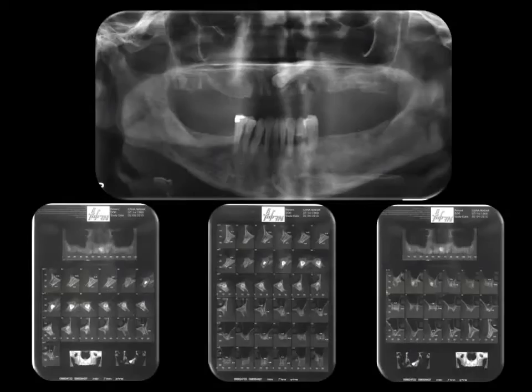Case 1 describes a full mouth rehabilitation. The required procedures are as follows. 1. Extraction of impacted canine. 2. Bilateral sinus lift. 3. Implant placement. 4. Augmentation in the required sites. 5. Immediate loading with provisionalization.